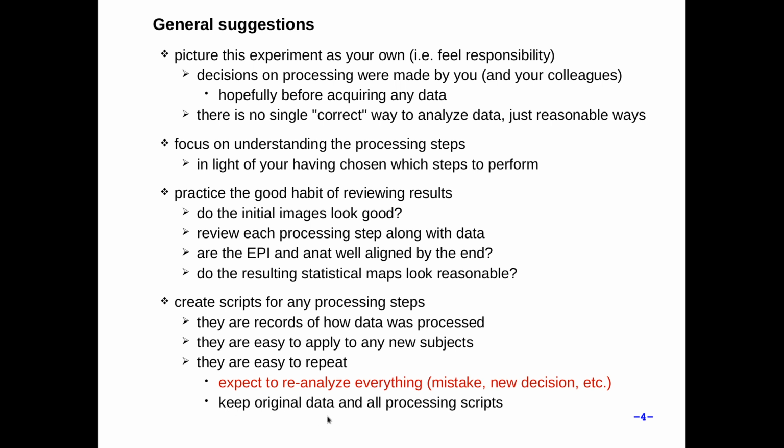And then you keep all the original data and all the processing scripts, and then you can effectively repeat the analysis anytime. That also actually goes along with being consistent about the version of the software that's being used.